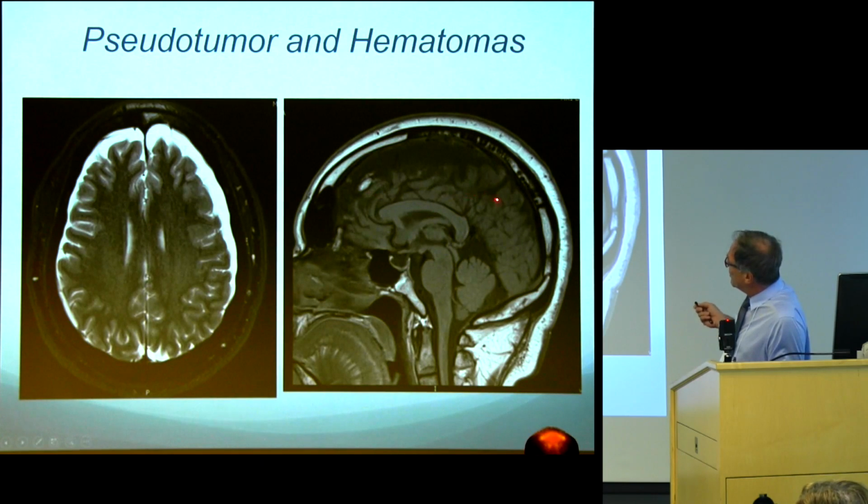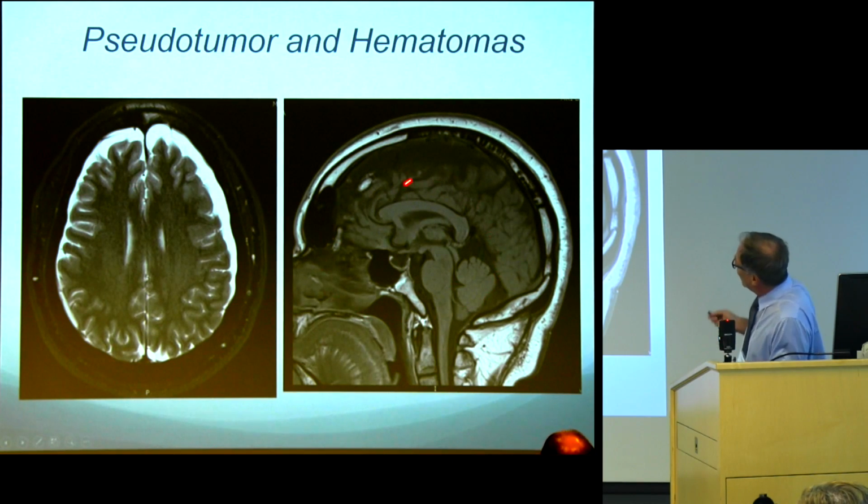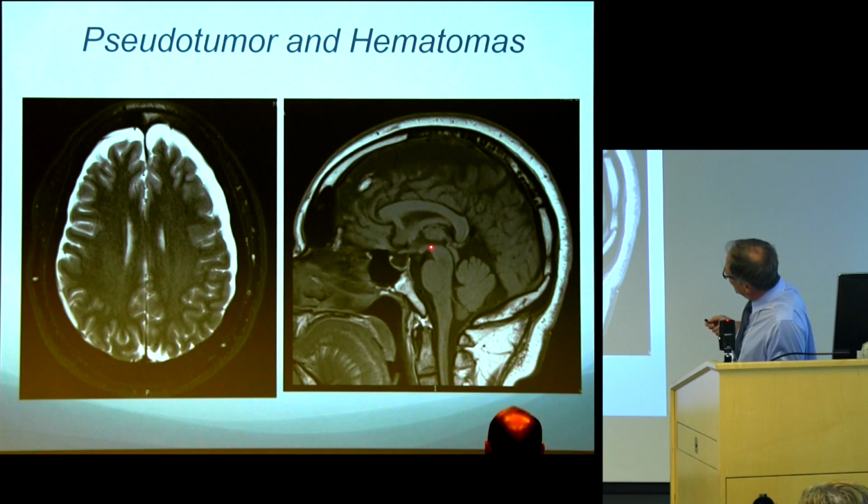Well, you can see the images here of the MRI, and I'll show you other CTs next. But you see again, subdural hygromas. And you see a lot here that indicates different CSF abnormalities. You can note the empty sella, the CSF in the sella region. There may be some posterior migration of the brainstem downward. That's very slight. If you measure from the top of the posterior clinoid up to the top of the tent, the aqueduct here is behind that. That's by some an indication of some migration backwards.